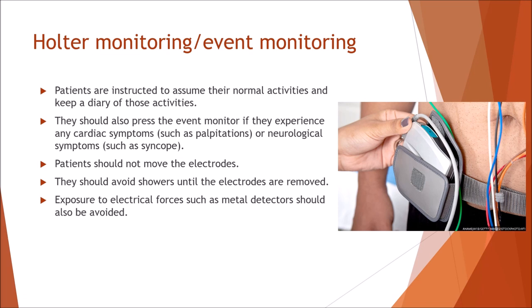And then they just wear it, right? Whenever they do feel something weird on their chest, they do press a button so that the doctor knows. The doctor's going to review all of this at some point so that the doctor knows at what moment they felt something weird. And they're also supposed to keep a diary so that, let's say, they were in a car wreck, right? Obviously, when the car wreck happens, the heart rate's going to go up. So then they would write another diary at 3:30 p.m., you know, I was in a car wreck. So then when the doctor reviews it and he sees that there's a spike in the heart rate, well, he knows why. There was a reason for it. And that's pretty much what a Holter monitor is.